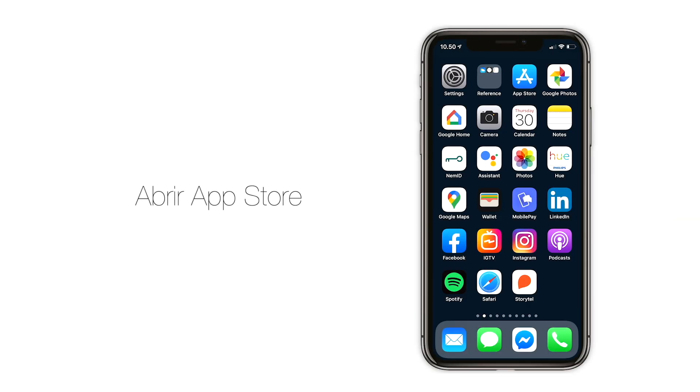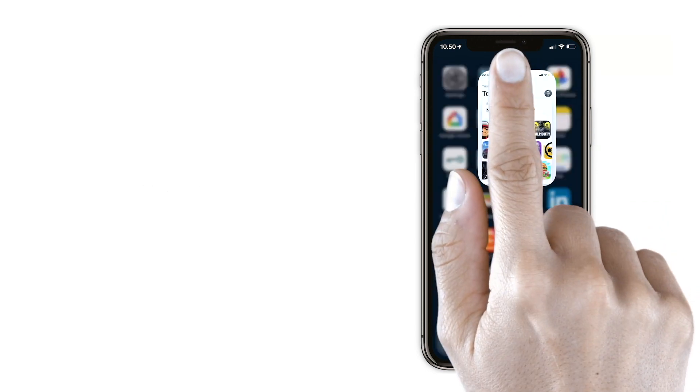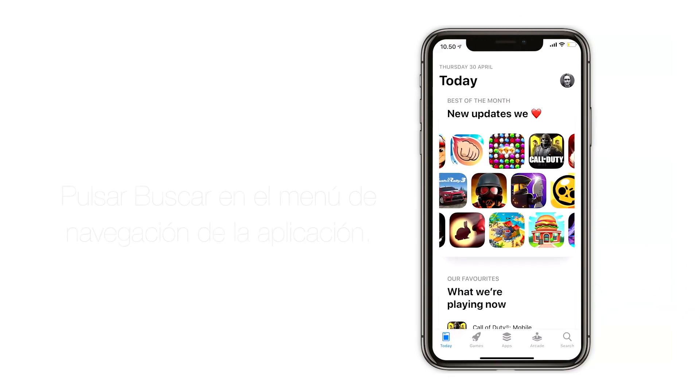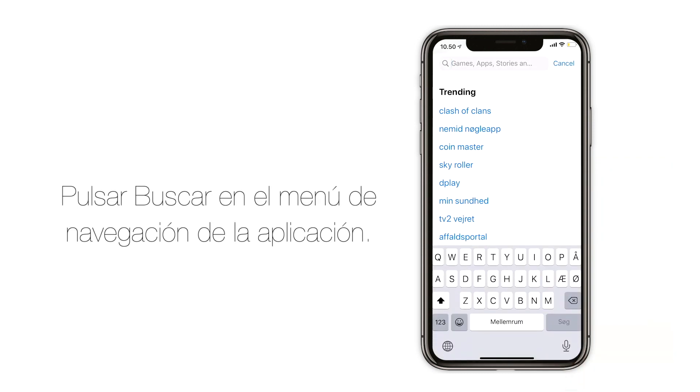Open the App Store app by tapping the App Store icon. Tap Search in the app navigation.